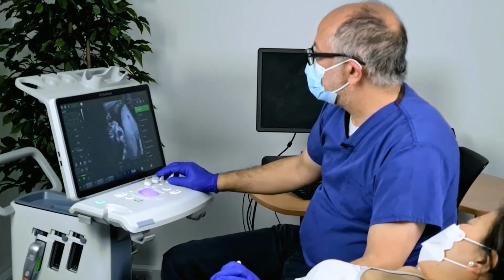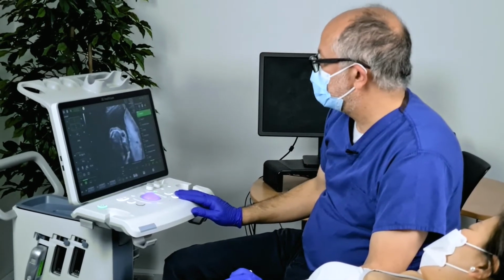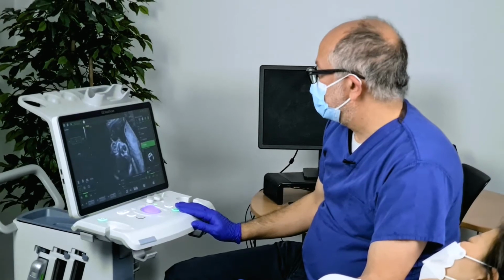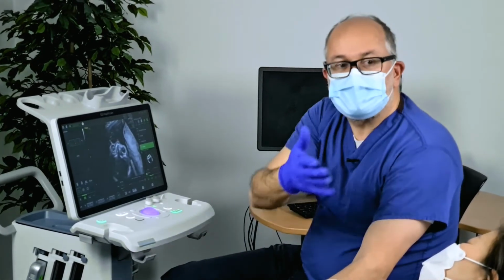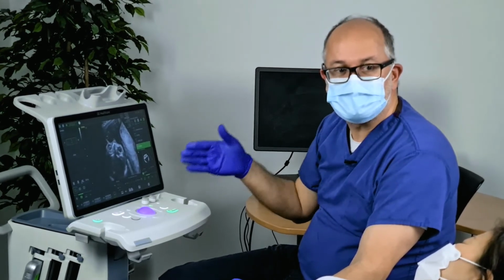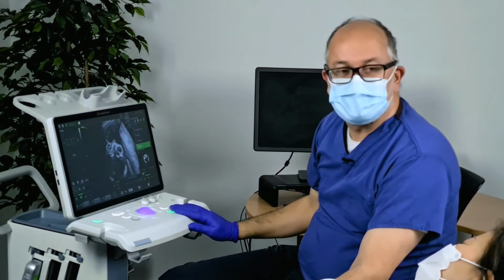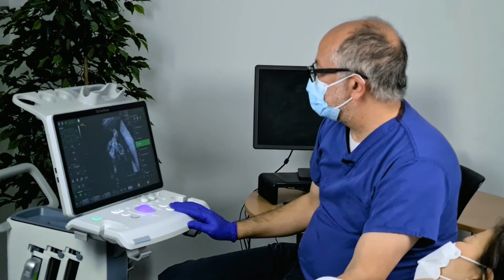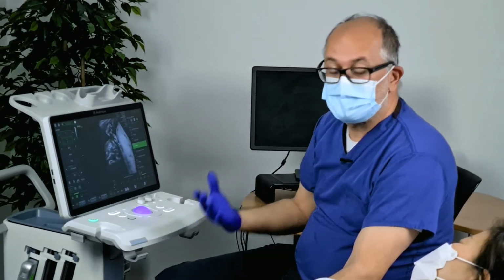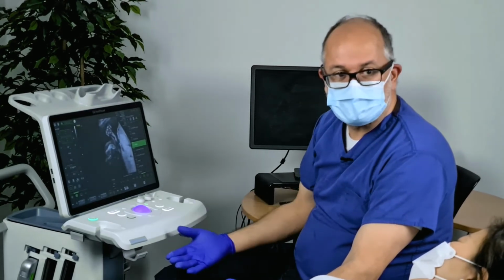Now, one of the reasons this is so useful is that babies change position all the time, right? So if I were to do a scan in you and I was looking at your liver, I would have a very set way of how I do things. But in babies, you can't do that, because sometimes you start a scan and the baby's facing downwards. So you can't start with a profile. You need to start with a spine.